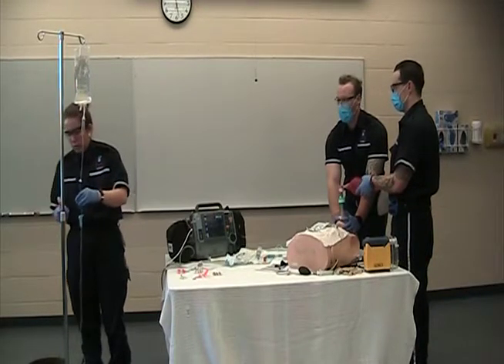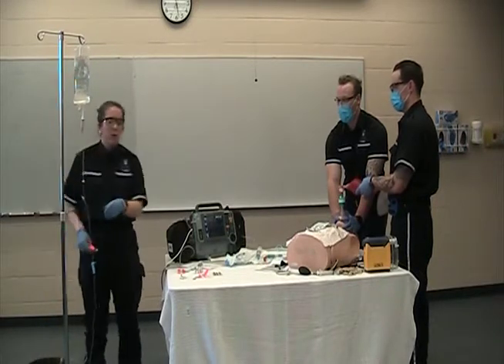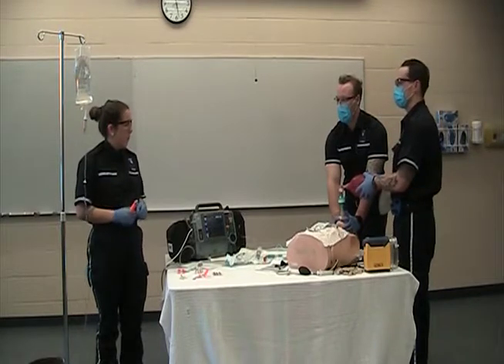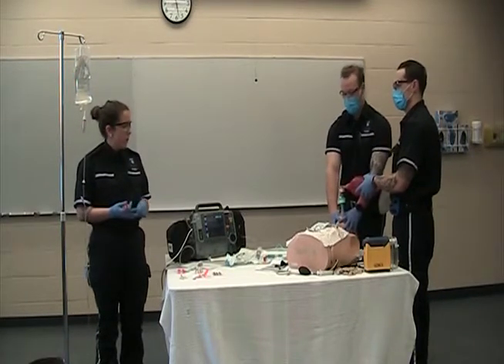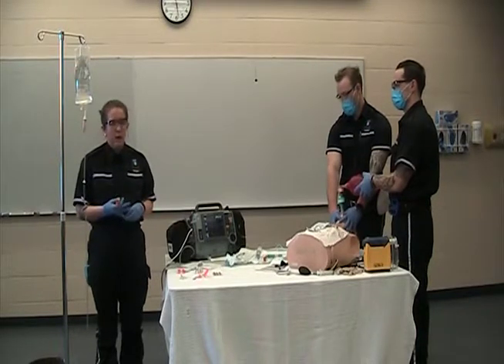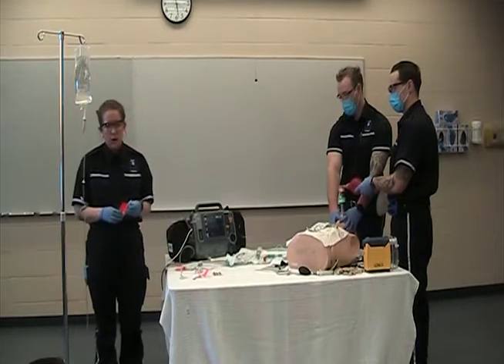Perfect. So 12 mils of ketamine have gone in. As I mentioned, we're looking for signs of sedation. So assessing our patient, we want to assess their level of consciousness, and if they're looking a little bit dissociated, once they do look dissociated, we can move on with succinylcholine. It takes about a minute to work.